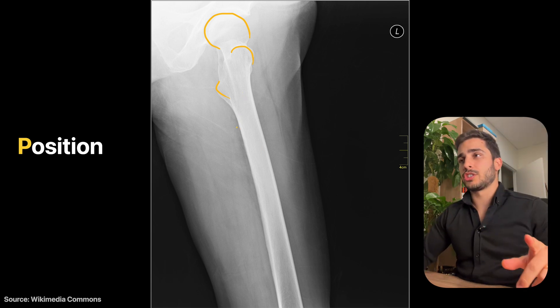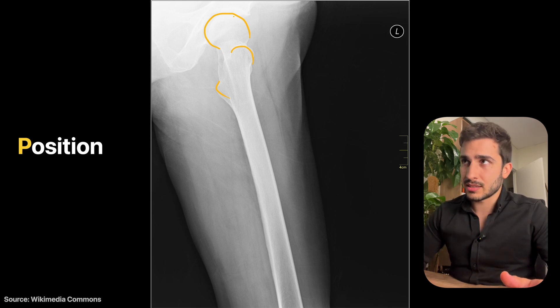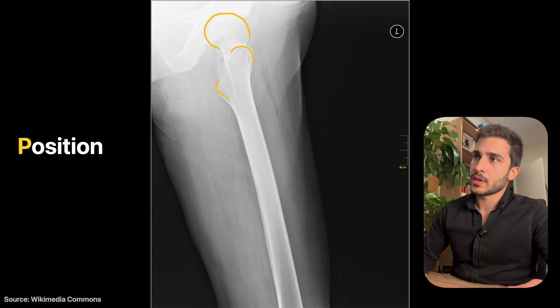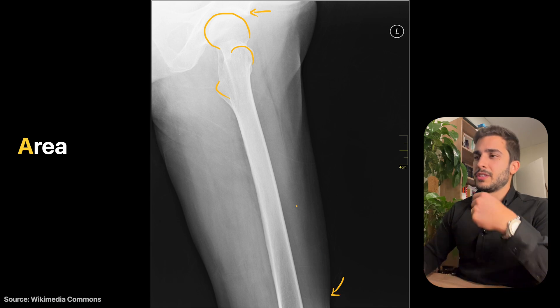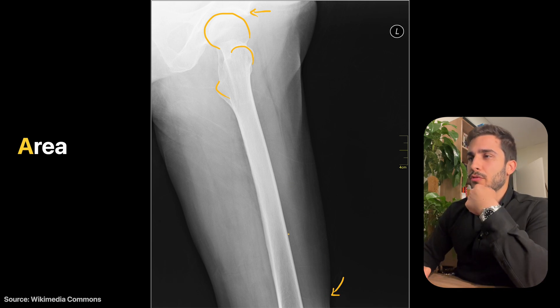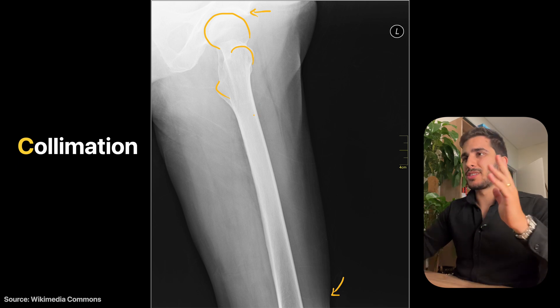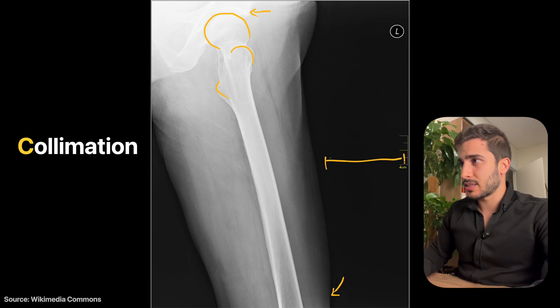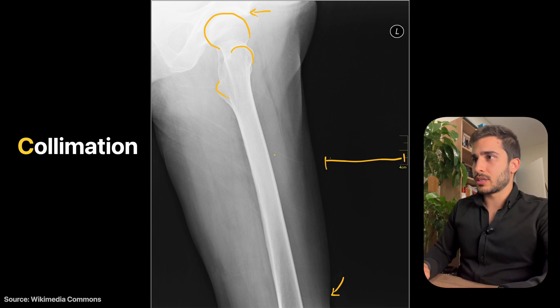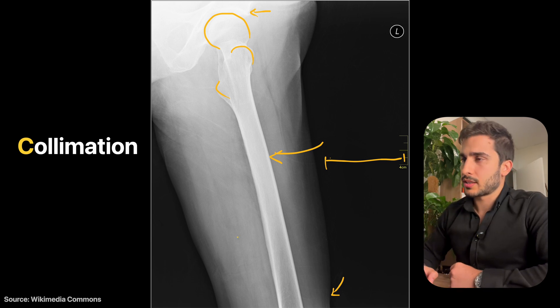In terms of rotation, it is sufficiently rotated — this is what a lateral profile of a hip looks like. The area covered is adequate: enough of the femoral head is visible and as much distal femur as possible before the knee joint. Collimation top-to-bottom is very good, assumed to be maxed out. Side-to-side collimation could be improved — shifting the centering slightly onto the patient and bringing collimation in would have helped.